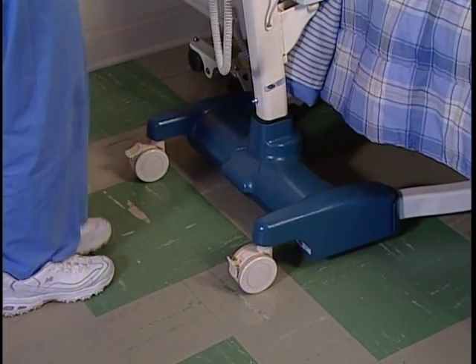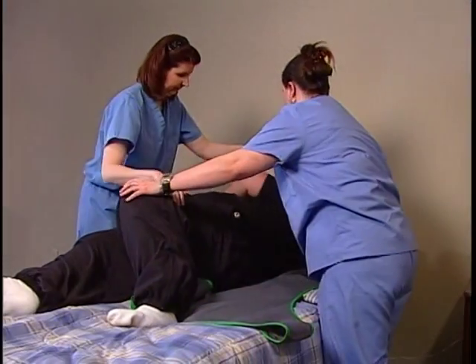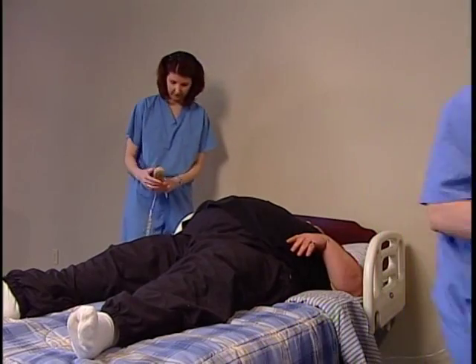Unlock the casters and move the lift away from the bed. I got your shoulder. Roll the resident from side to side to remove the sling. Okay, do you want to sit up or rest for a while? You know, I think I'll sit up.